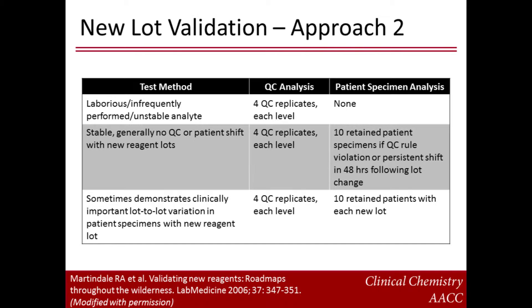Performing this process for all tests and all new reagent lots is very time-consuming and may also be cost-prohibitive for many laboratories. In 2006, Martindale and colleagues published a modified approach that relies on past experience with the test, along with the results of QC measurements, to decide whether patient comparisons should be performed prior to introducing a new reagent lot. Martindale and co-workers divide tests into three groups. The first group includes tests that measure very unstable analytes, use highly unstable reagents, are very laborious or time-consuming, or leave little or no specimen after initial analysis.